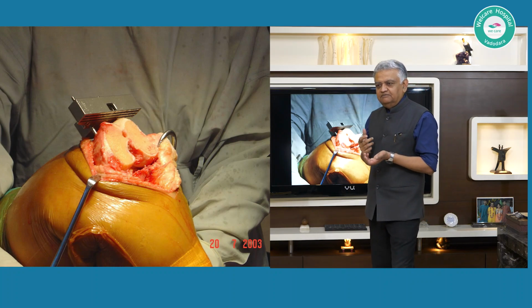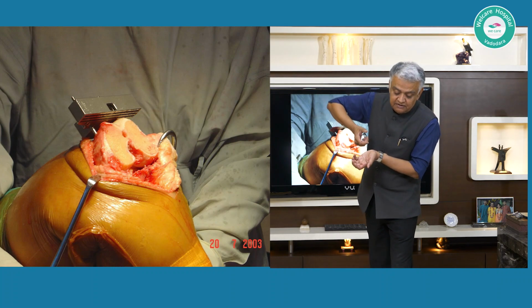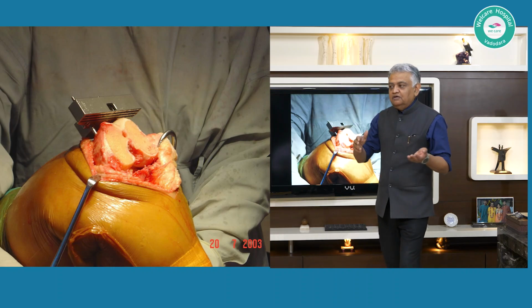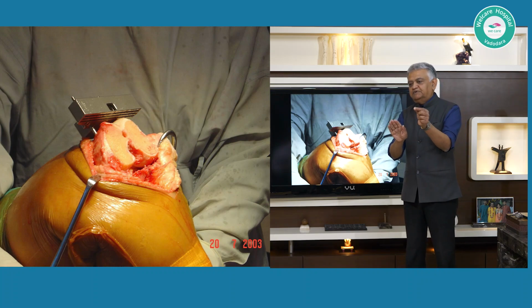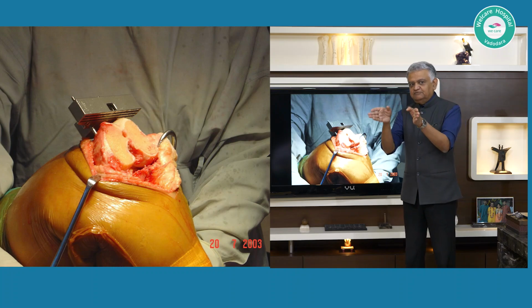और वो जब आपके हाथ में आ जाएगी तो फिर आप जब कर रहे हो तो you will not be struggling कि मैं क्या काट रहा हूँ, वो देखने में इधर ऐसा ऊपर कर दिया है saw आपने, तो you are dipping the saw into the bone. और saw लेते समय कौन सा saw है, ब्लेड को देखा, ब्लेड की edge पर अंदर से उसका teeth अंदर curve हो चुका है, actually that is where the cutting starts from.